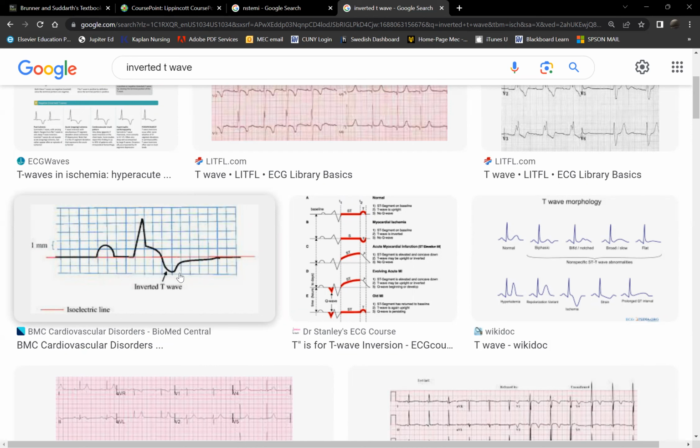This indicates either a new or an old heart attack, meaning are there cells there? Are there ventricular cells that are not repolarizing at all? Yes, that's the indication. Again, what does it indicate? Either a new or recent or an old infarct. Meaning the patient must have suffered a heart attack now or recently or long ago. All right. So that means there are portions of the ventricles of this patient's heart that are now scar tissue.